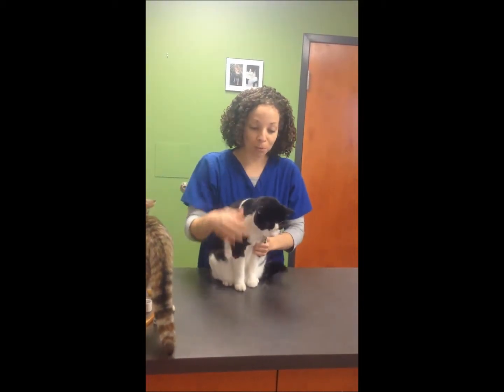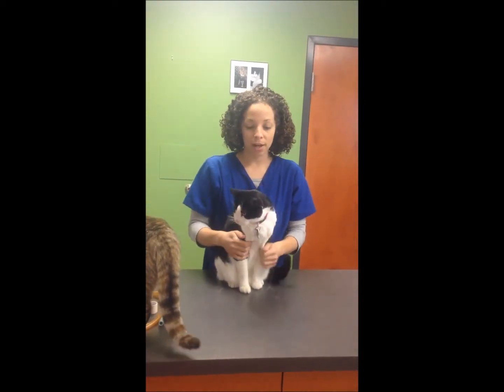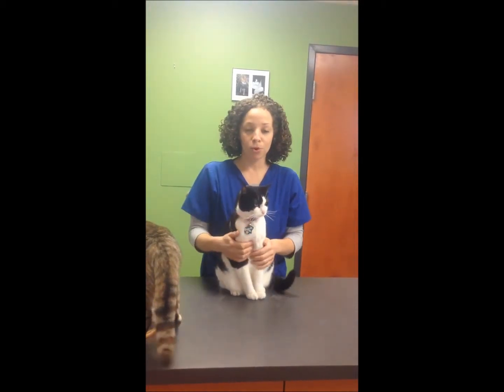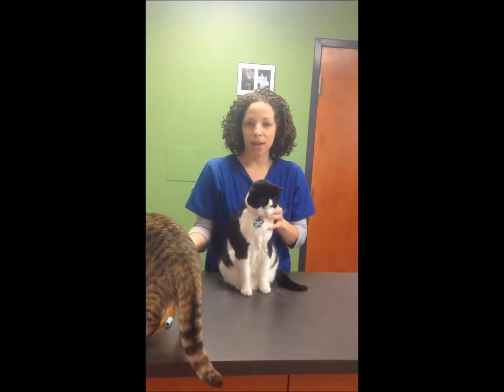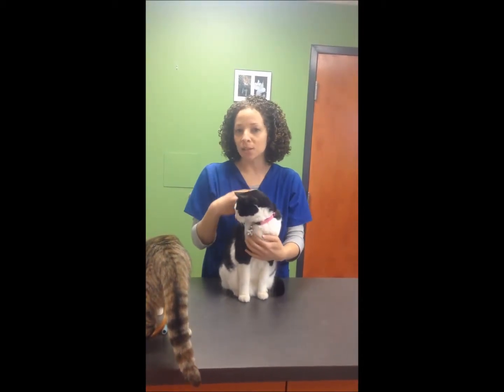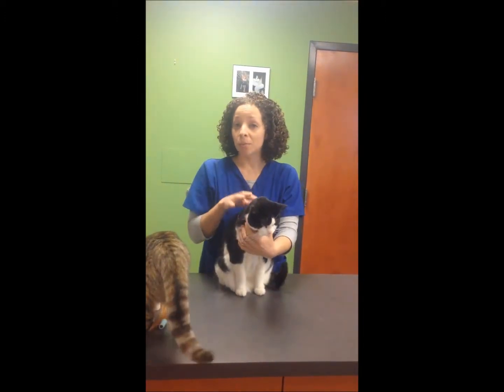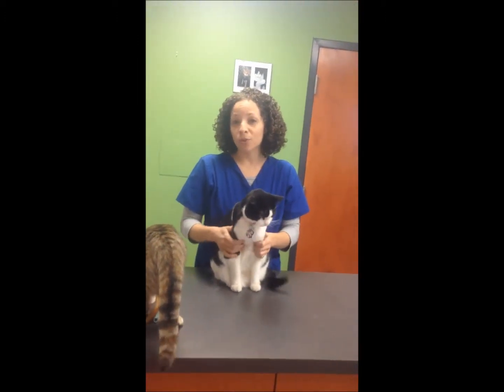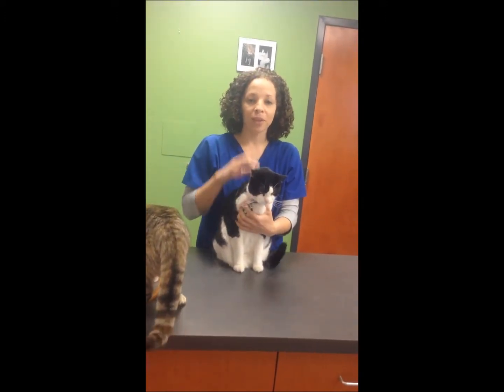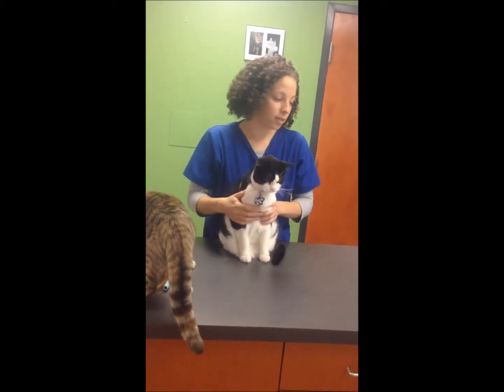So for Miss Mona, basic things that we would want to do to get her ready for the study, we would want to make sure that she was fasted for at least 12 to 24 hours before starting the study, just to make sure that there wasn't any food matter that might possibly obstruct lesions or different things that we were looking for in the GI tract. We would also want to administer an enema about 2 to 4 hours before doing the contrast study to remove any kind of gas artifact or feces that also might obstruct our view during the study.